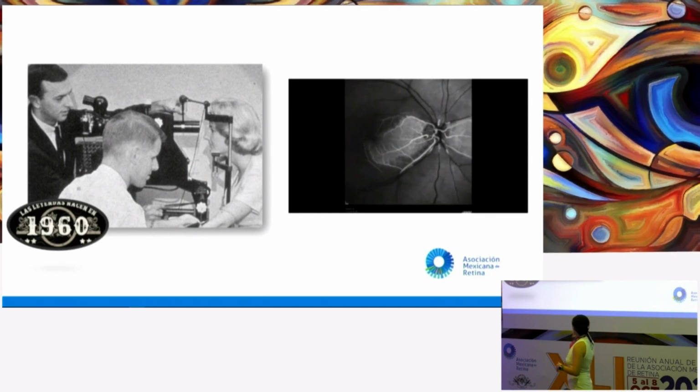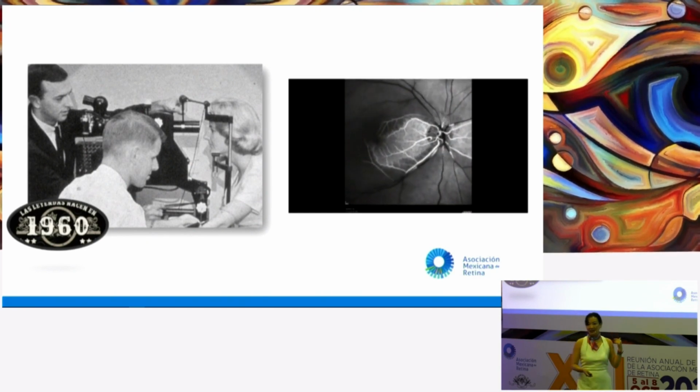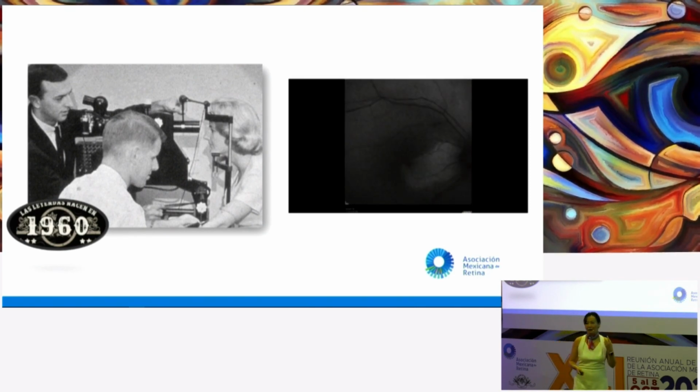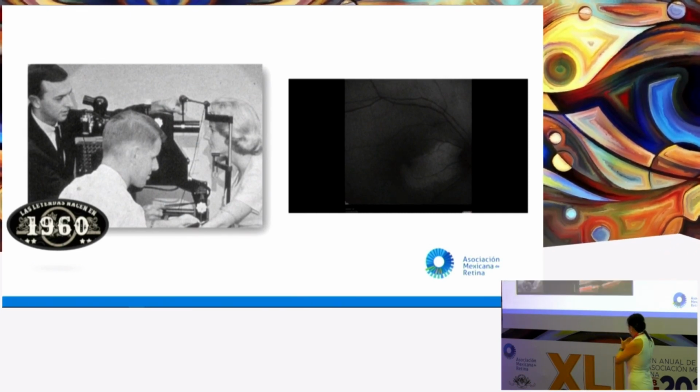If we get to dim the light, then you will see the angiography. Your brain is already trained, and then you say, we are on this trace, we are in hypo or hyperfluorescence. You know all the phases. Your brain is trained to know what is going on here.